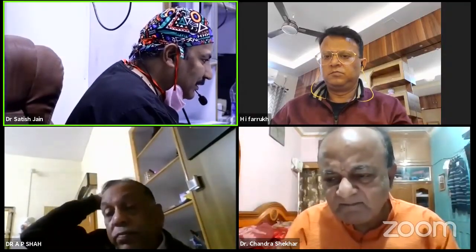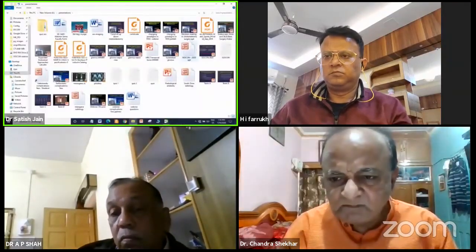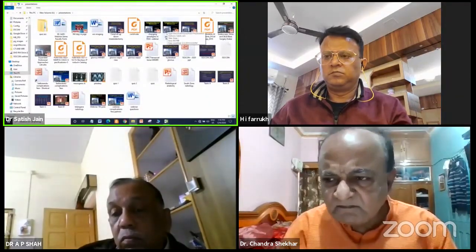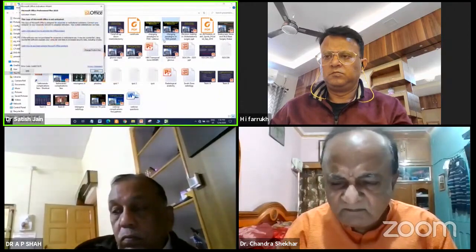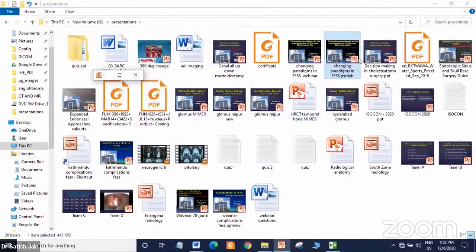What is the douching material, Satish? The douching material we use is basically the budesonide solution. And budesonide is the one we mix in saline and do a high volume irrigation reaching paranasal sinuses. So let me show you the Namaz position. Yes, Namaz position.